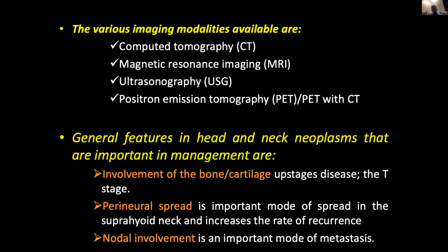It's very important that you assess whether the disease is crossing the midline, because the moment the disease crosses midline, you should target looking for nodes on the contralateral side. So we have to be very, very accurate in our assessment. The moment tongue disease crosses the lingual septum, that means it is crossing the barrier and it is going on to the contralateral side, then your thought process should be that you have to look for nodes on the contralateral side.